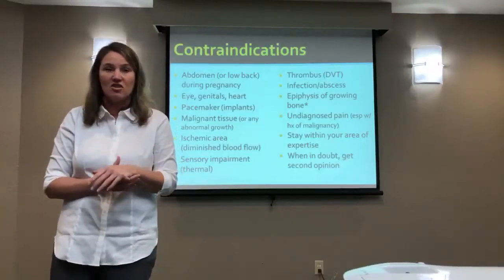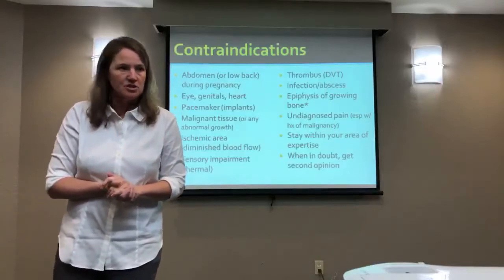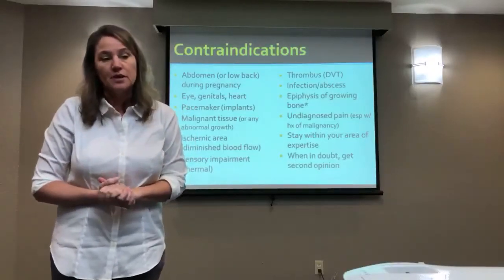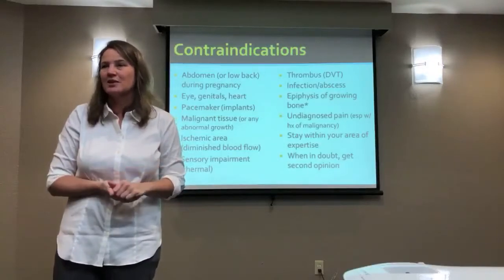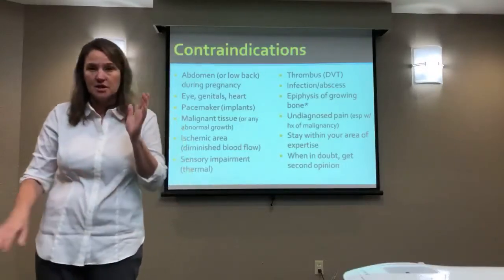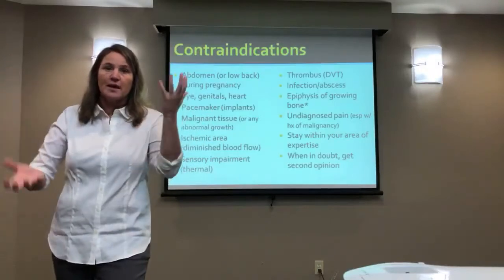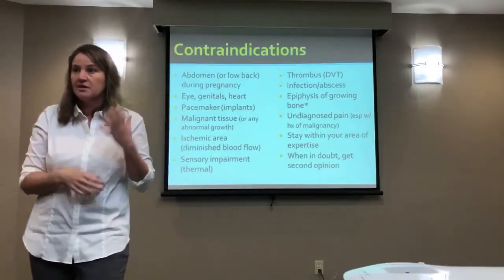Adequate sensation is going to cause you to, I mean, we're going to do ultrasound on each other during the lab, and as soon as it gets uncomfortable, you will reflexively pull away if it hurts. So assuming that this patient had blood flow and had sensation, it's hard to imagine they could get damaged muscle. But okay, if they have good sensation but impaired blood flow, it's not that you can't do it. You've got to weigh benefit and risk and think, is it worth the risk, and consider the risk.